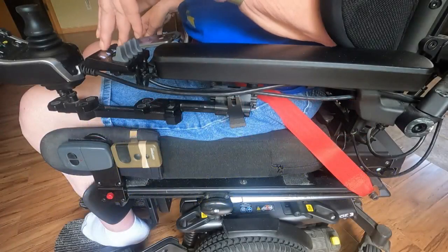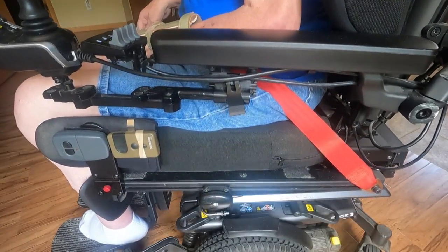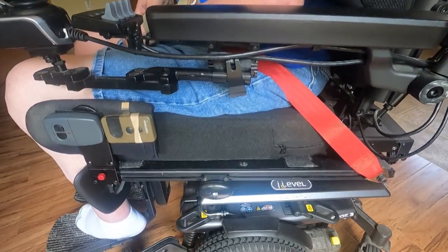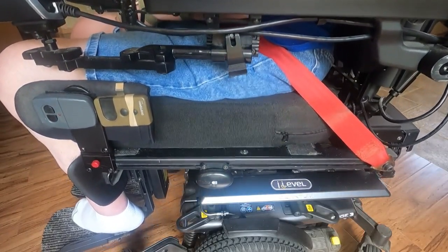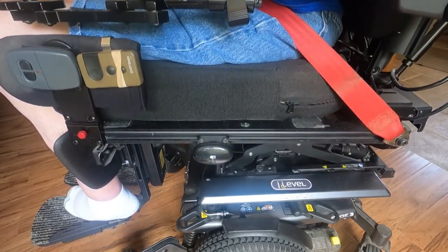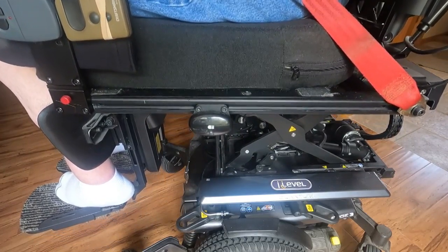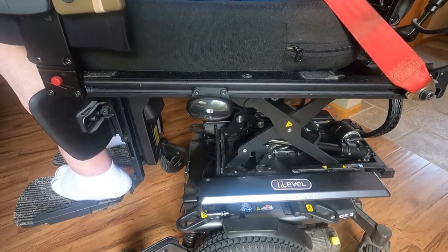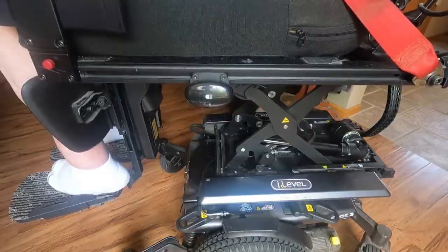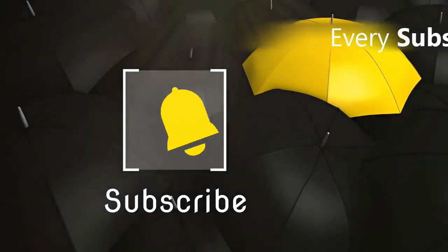In this episode, I'm going to answer some inquiries I've been receiving regarding the controls on my power chair. As I currently own a Quantum Edge 3, my comments will be centered around this model and may not apply to all Quantum models or power chairs by other manufacturers. IBMers contemplating their first full-featured power chair can pick up some useful tips from this video.